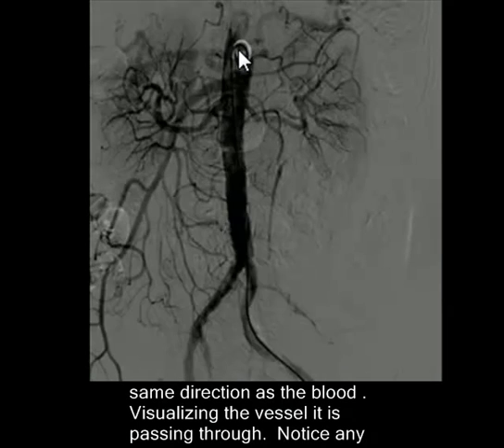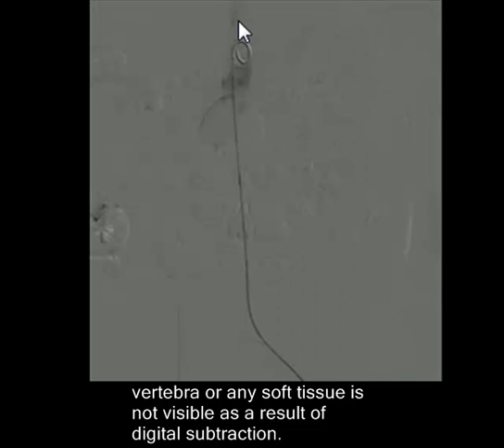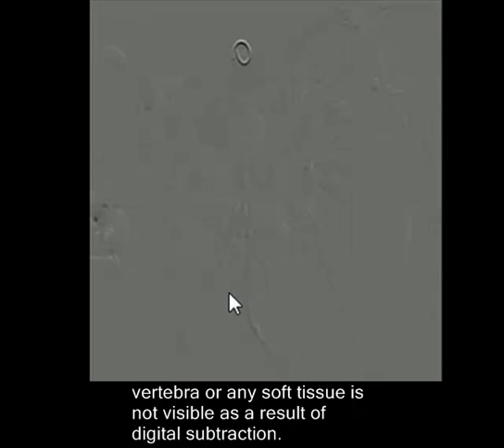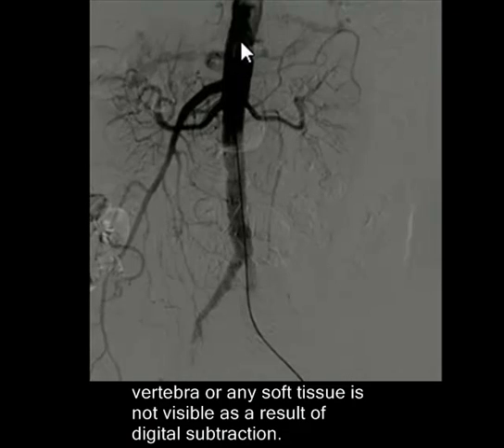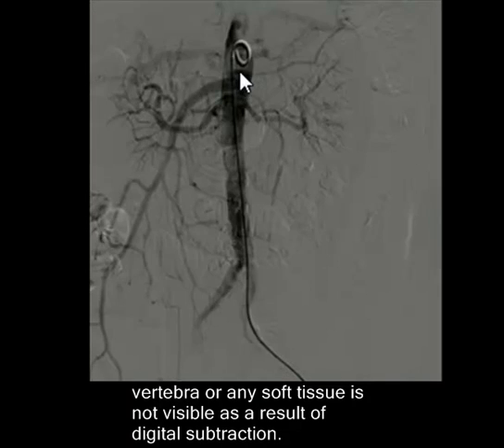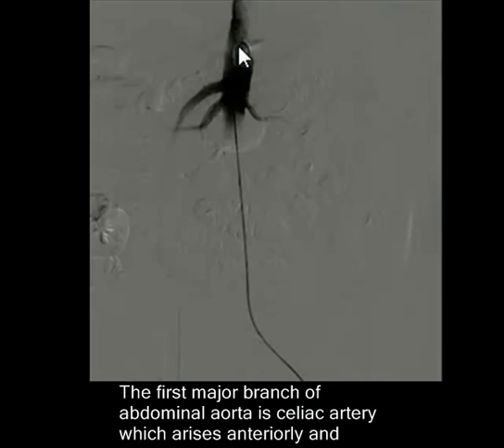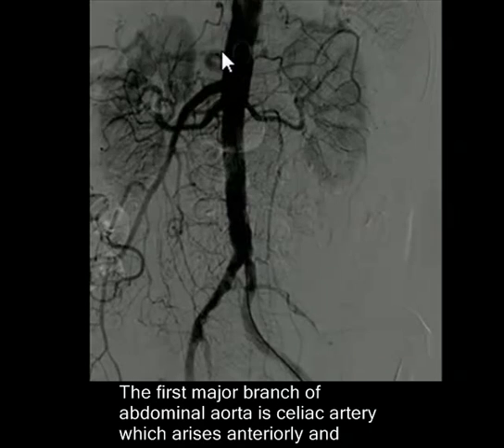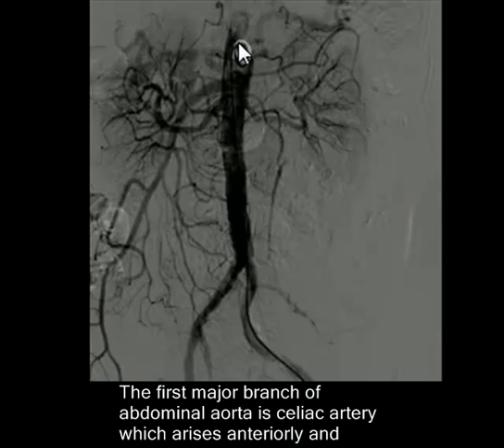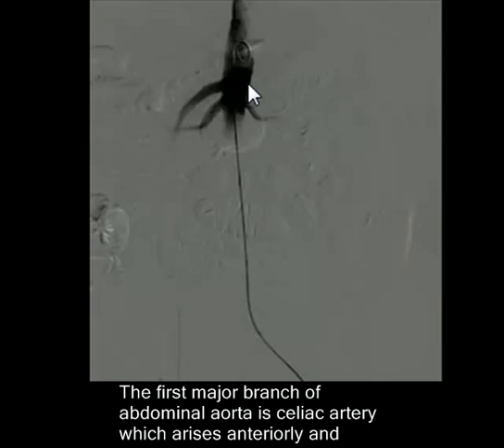Ideally the tip should be above or at the level of the 12th thoracic vertebra so we can see the whole of the abdominal aorta. In this case it is probably just below the ideal position. So the first major branch, known as the celiac artery or celiac trunk, is just visible. If the catheter were just above this point, you would be able to clearly see the three branches of the celiac artery.